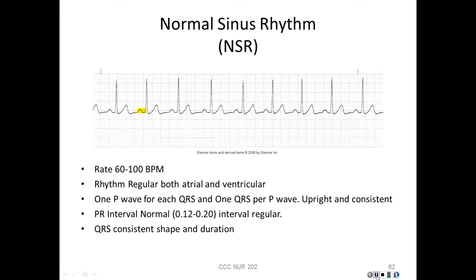As you approach the rhythm strips, I want you to approach them with one thing in mind. Do not treat the strip. Again, do not treat the strip. Treat your patient. I don't care what you see going across the monitor. Always assess your patient. If I ask you a question about a rhythm strip and you do not have an assessment on that patient, then you're to assess your patient. Same thing when you go to boards. If they don't give you an assessment, look at assessing that patient as part of your process.